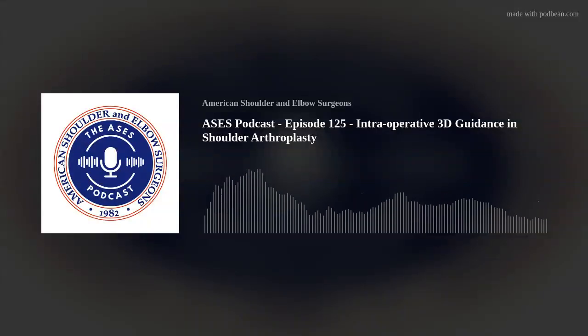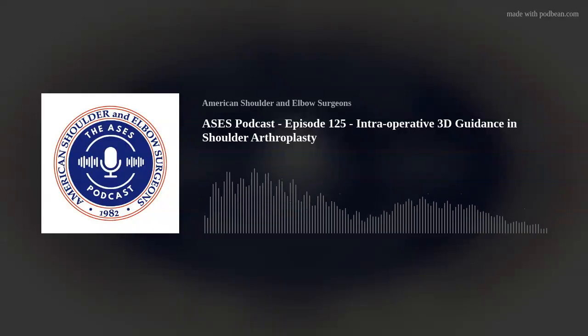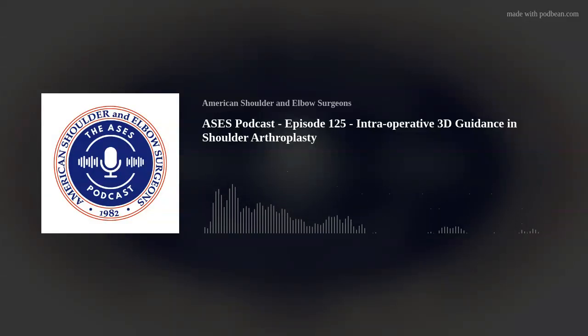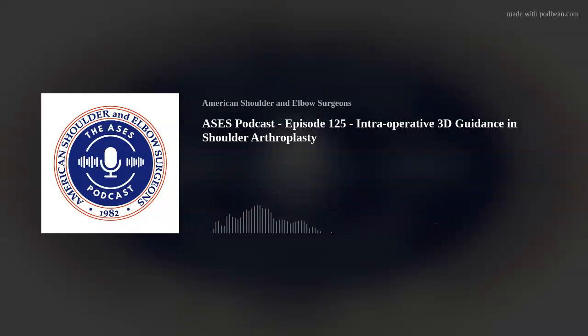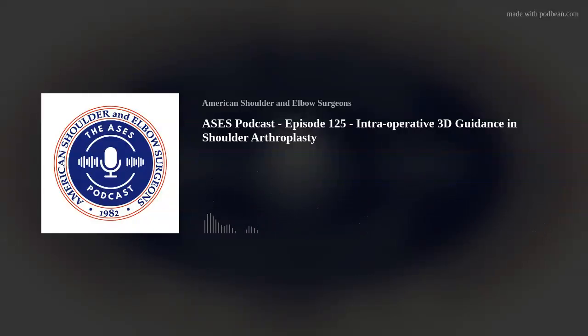I, again, try to keep it within 10 degrees of neutral as far as version goes. I won't do more than 10 degrees of retroversion on the face of my component. That's without the augment correction. And I won't do any superior tilt. I am perfectly fine at neutral. If a few degrees of inferior tilt requires me to remove less subchondral bone, I will do that. So 10 degrees of version, neutral or inferior tilt are the targets that I'm looking for, along with a millimeter or two of inferior overhang with the prosthesis that I use.